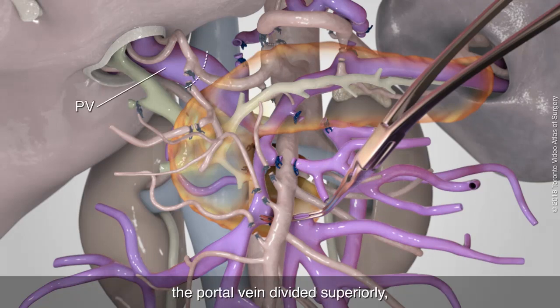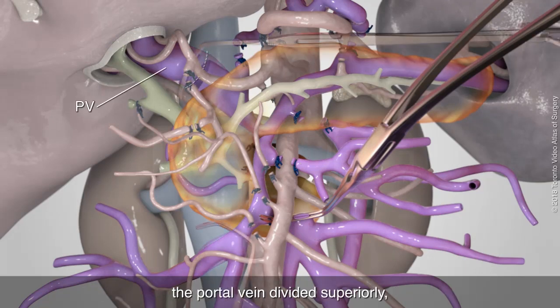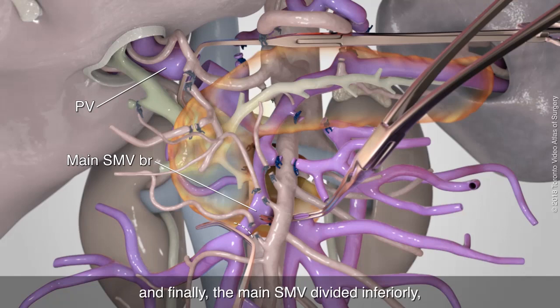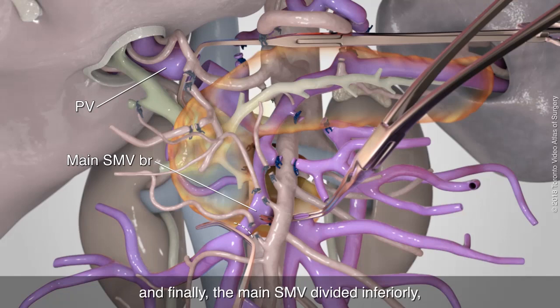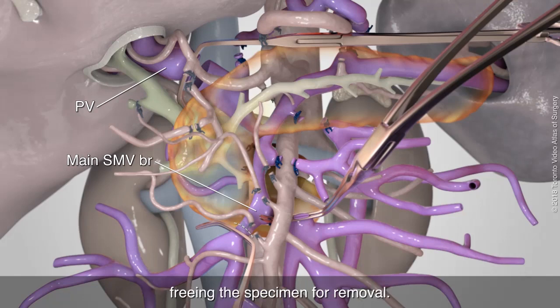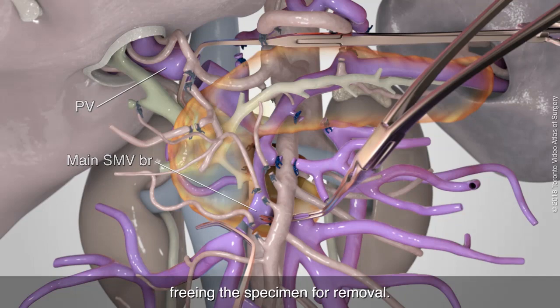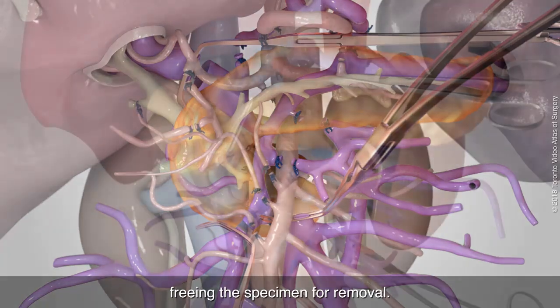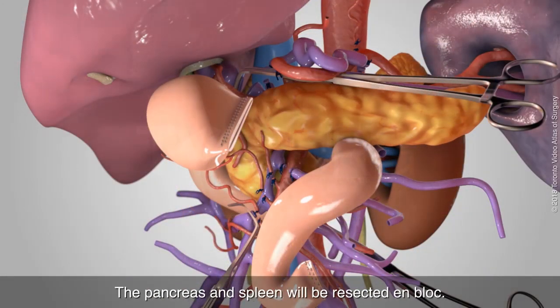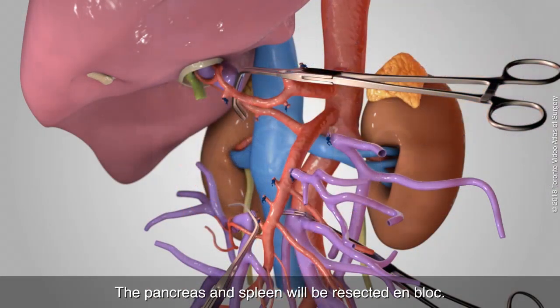The portal vein will be divided superiorly, and finally the main SMV divided inferiorly, freeing the specimen for removal. The pancreas and spleen will be resected en bloc.